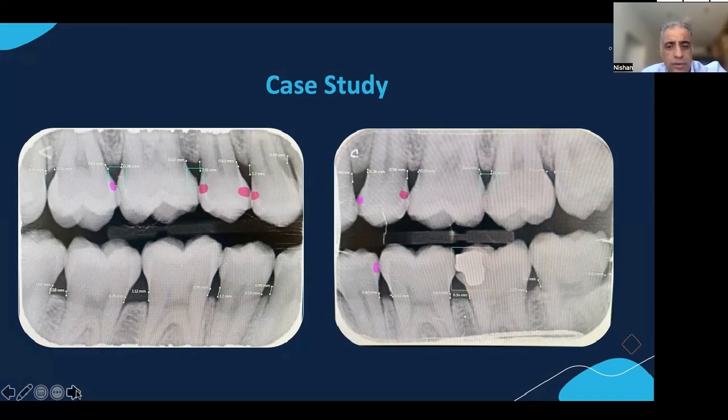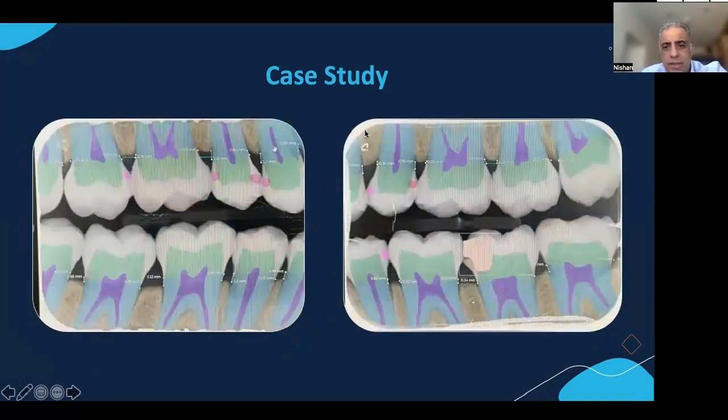for the restorative work. We put it into the colour as well, and you can quite clearly see that some of these lesions had gone into dentine and needed active intervention. And on the 6, he could quite clearly see the deficiency in the restoration.